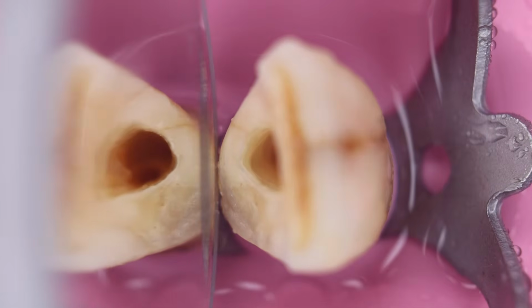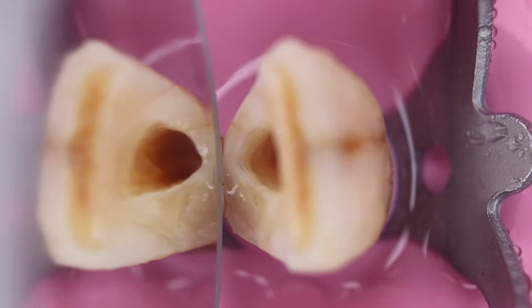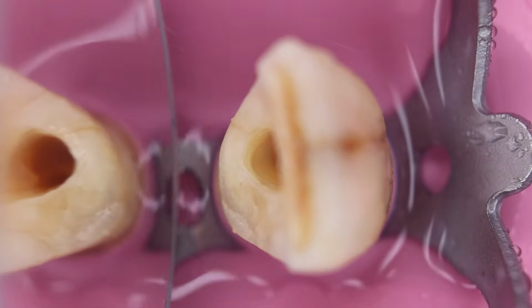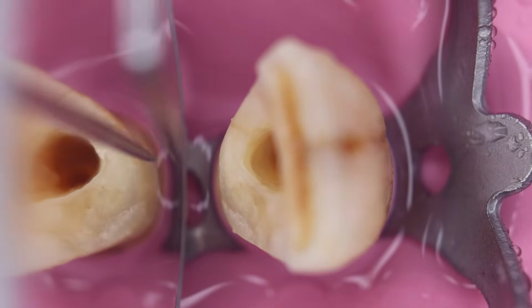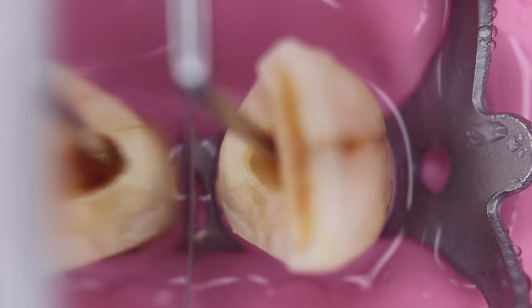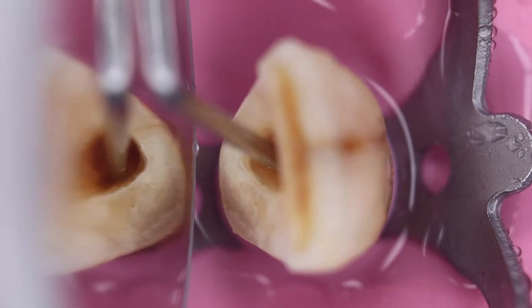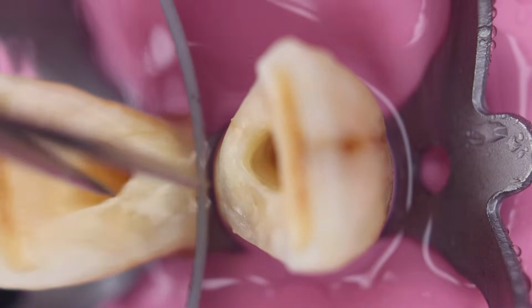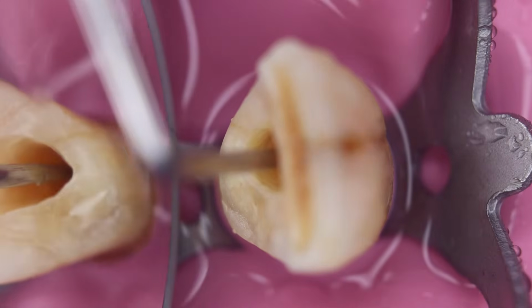So now you are able to appreciate the opening that we have formed for this tooth. This tooth root is being directed towards the distal aspect, as we can appreciate with the opening over here, and we have formed a rough triangle over here with a straight line axis.